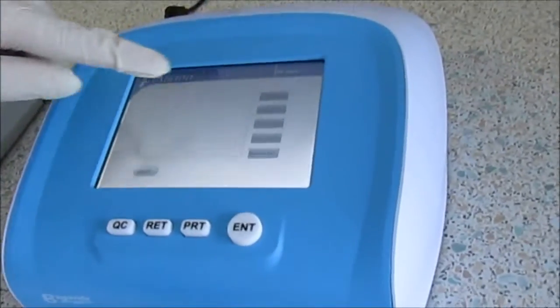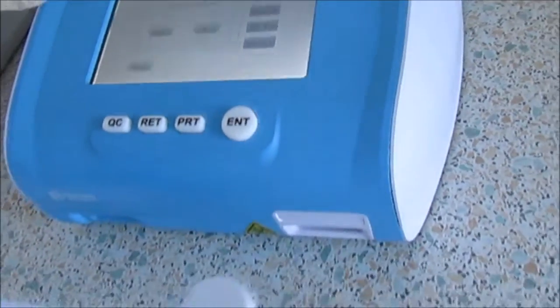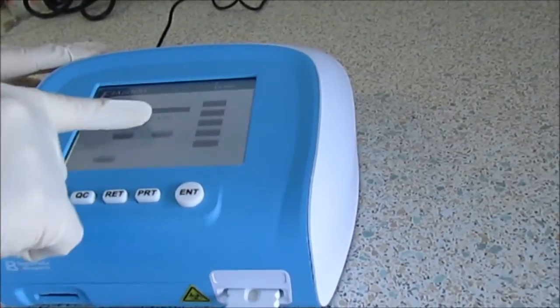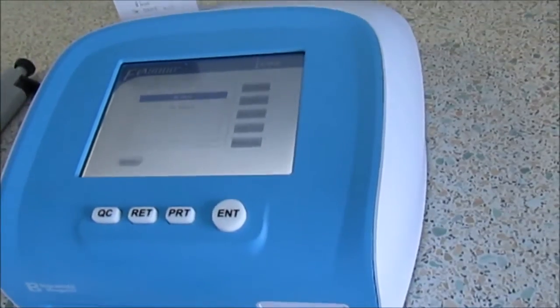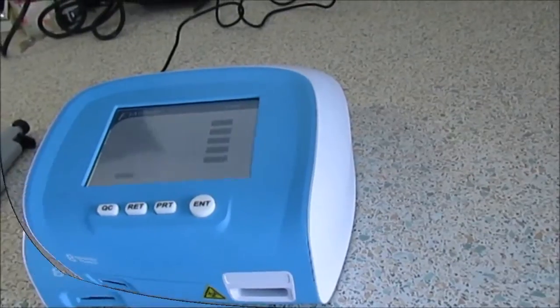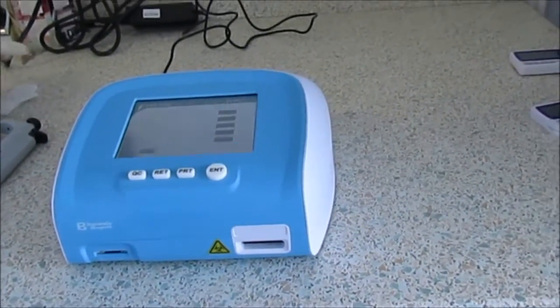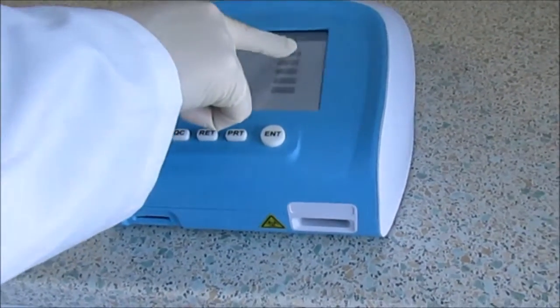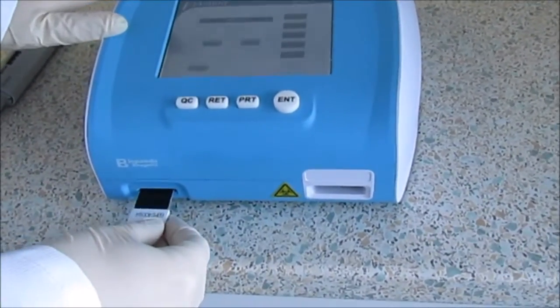A quality control cassette is provided with the analyzer and may be performed before operating the device or after a period of time to ensure accurate testing. Insert the QC card and perform the calibration following the instructions on screen. Each batch of tests comes with its own SD card to ensure further quality control. The SD card is inserted into the FIA8000 and the QC calibration is performed by following the instructions on screen.